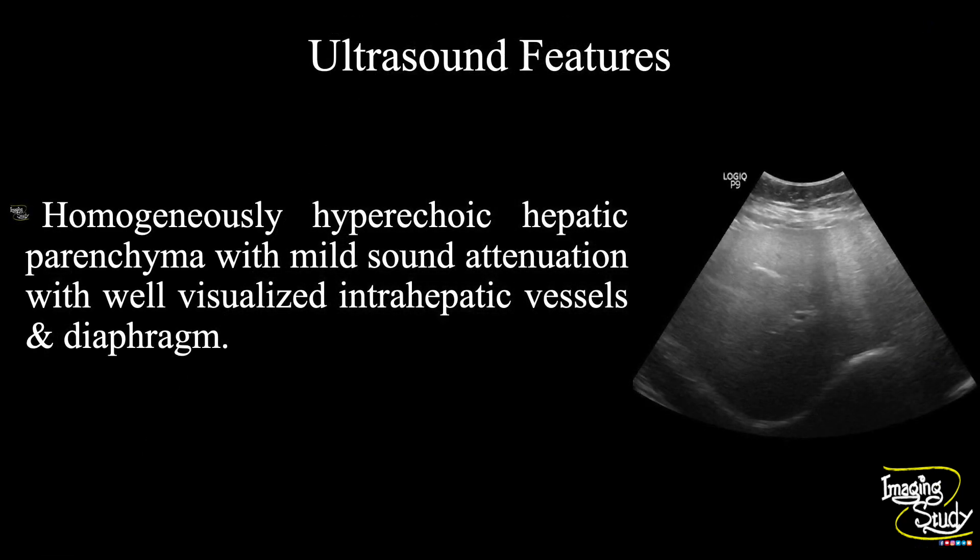In summary, a homogeneously hyperechoic hepatic parenchyma with mild sound beam attenuation is noted. The intrahepatic vessels and diaphragm are well visualized. These features suggest this as a case of mild hepatic steatosis.